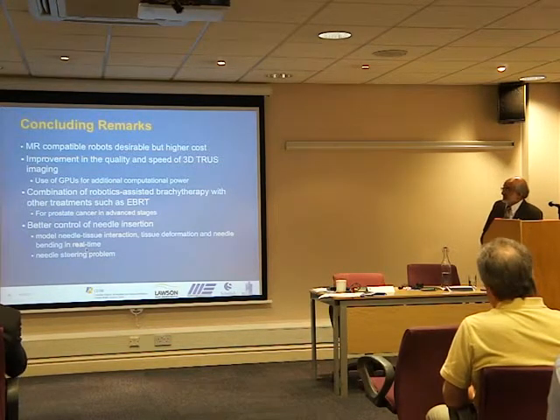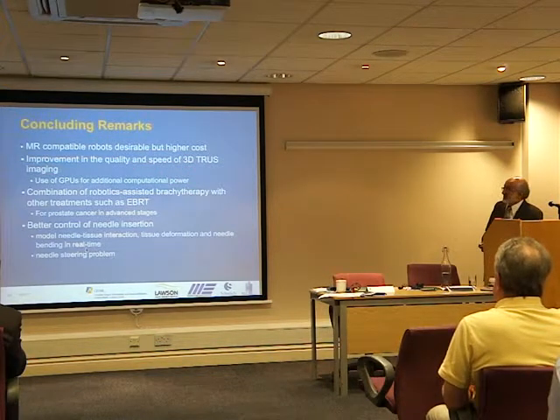So, to conclude, one of the few things that's happening next is people are looking more at MR-compatible robots. Primarily because clinicians get a much better idea about the prostate. The needle insertion is much more accurate, but of course there are very few ORs that are equipped with this. Real-time imaging with ultrasound is possible with graphics processor units, and we have some ongoing work as well as people at UBC and in the group at the Robotics Research Institute, and there are a number of other people working with the group at Harvard looking at this as well.